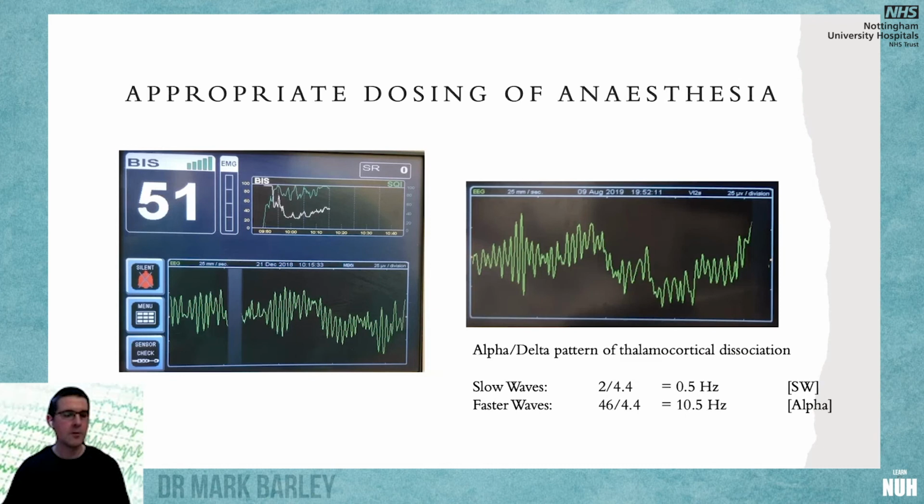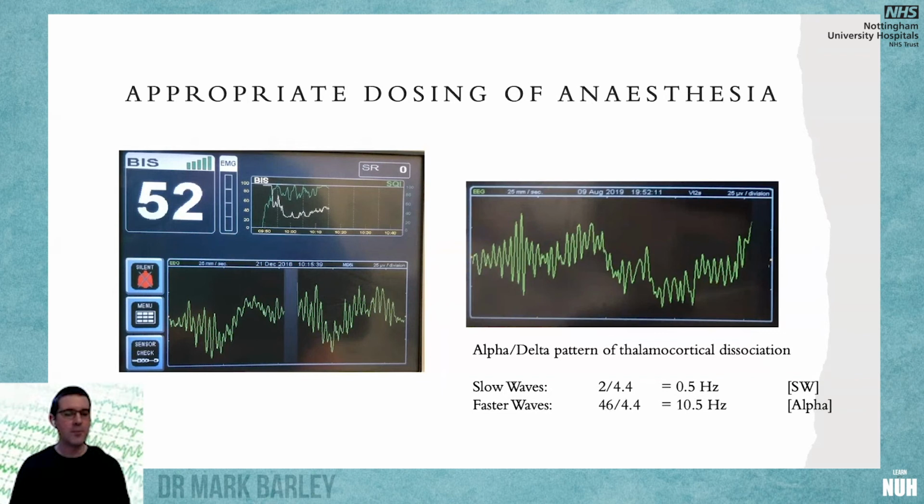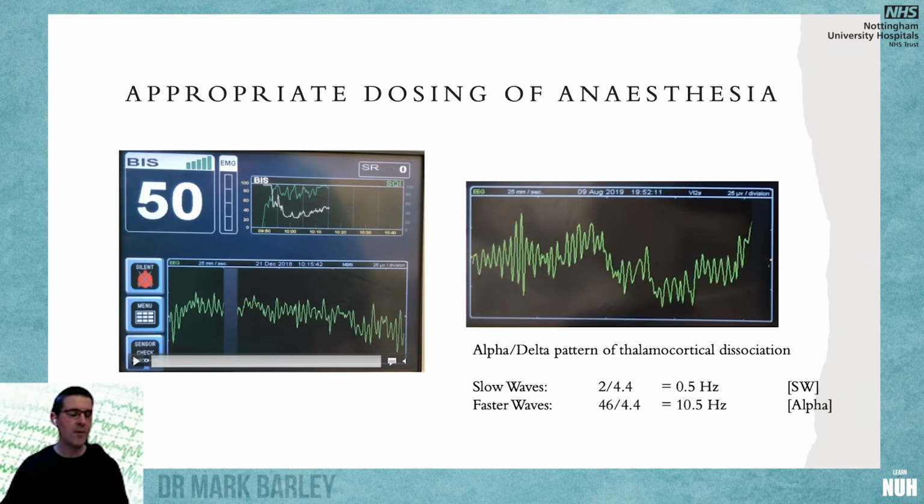I do think EEG is a very mobile signal because it's non-repeating. It's best to look at it as a video. I hope this works. So we can see here a nice reproducing signal where we've got an up and down undulation. Those are those slow waves coming from the cortex and from the brainstem to an extent, and this sawtooth baseline. If we look at it on this side, I've taken a photo and drawn on those oscillations again, and we can see just two peaks, one, two.